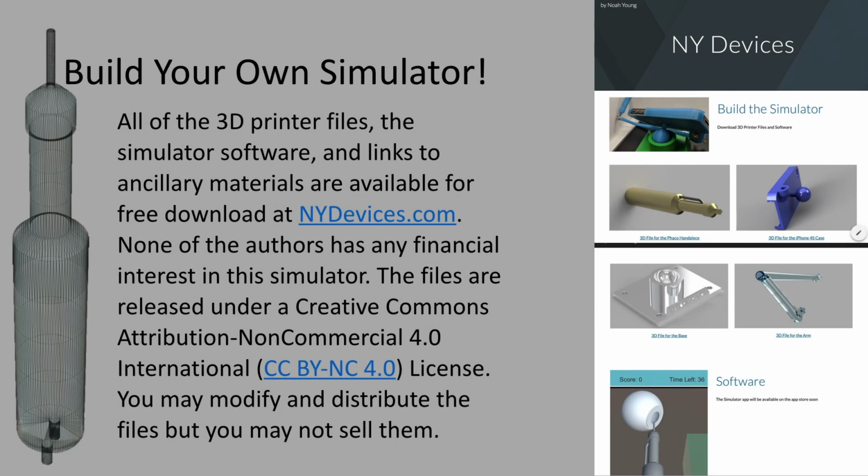Okay. All of the 3D printer files, the simulator software, and links to other materials are available for free download at nydevices.com. None of the authors has any financial interest in the simulator. The files are released under a Creative Commons Attribution Non-Commercial 4.0 International License. You may modify and distribute the files, but you may not sell them.